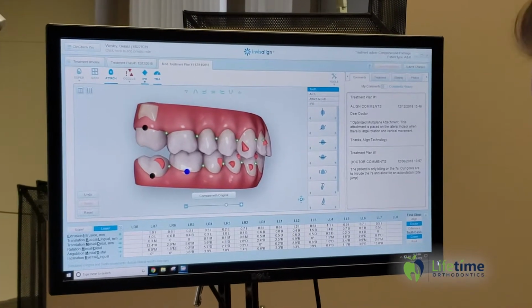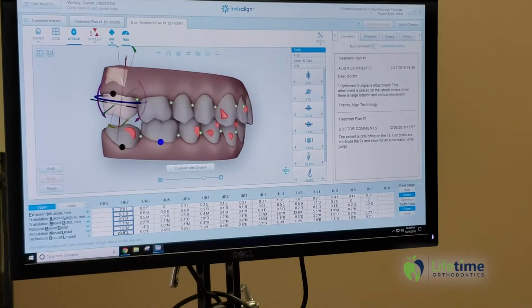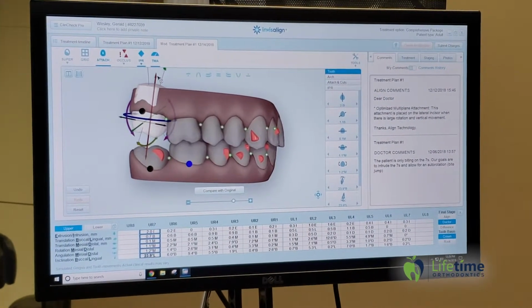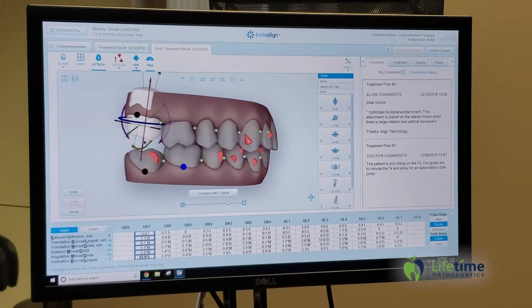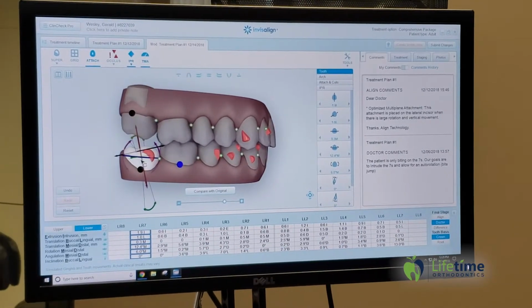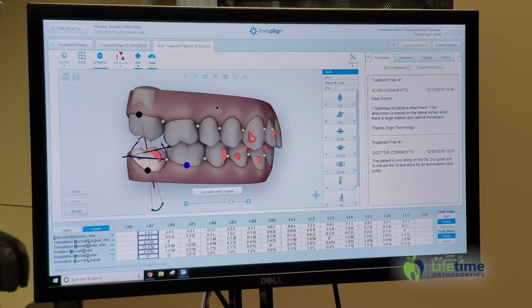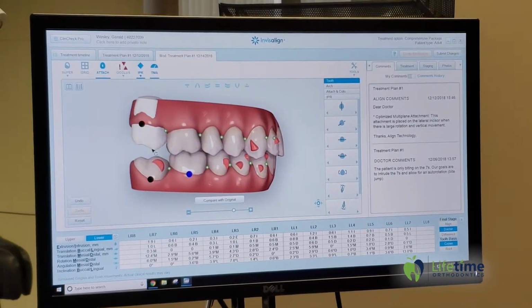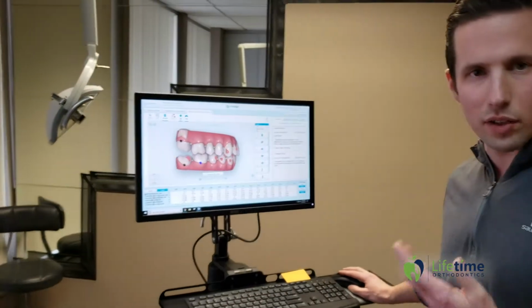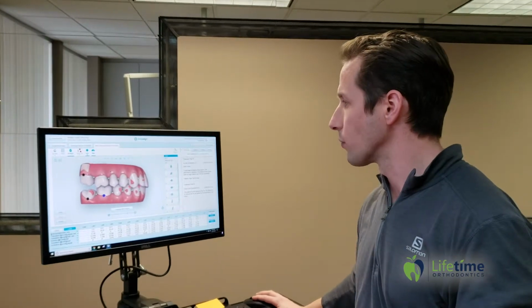And down here you can see the tooth movement. So this is our second molar, and I can see right here how much I intruded that, about 2 millimeters. I'd like to go maybe 2.5. So we'll go up here. That's 3. We'll go 2.7, that's good. And then on the bottom here, we intruded that. We'll intrude that about 2 millimeters there as well. Again, this is not going to be the final result. We always have to overcorrect, because just because I can do it on the computer doesn't mean my body, or your body, if this was your case, is going to react that way, okay?